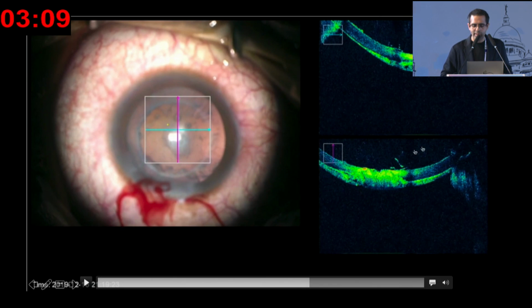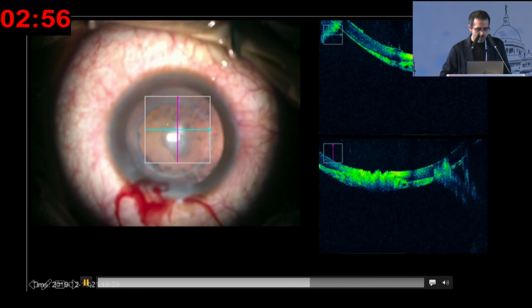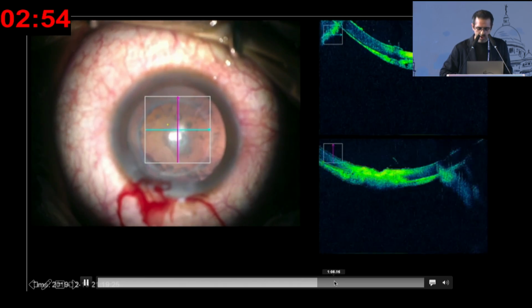Once there is only an epinuclear cushion, we do an ASOCT, and you can see very clearly this thick 1000 micron epinuclear cushion is protecting the posterior capsule, and it acts as a new posterior capsule. So at this stage, the major complication has been avoided. We cannot have a nucleus drop now. So now we start doing a very slow aspiration.